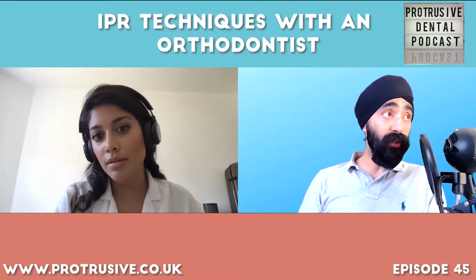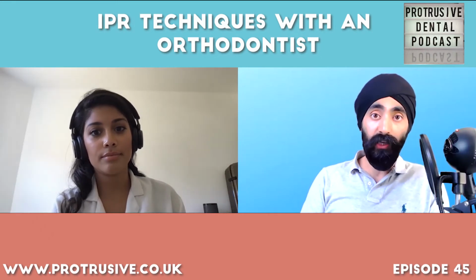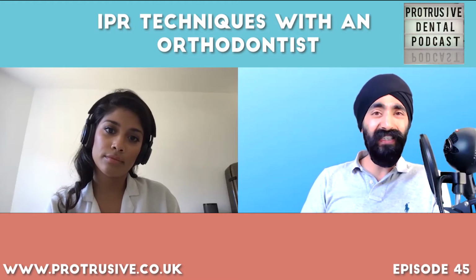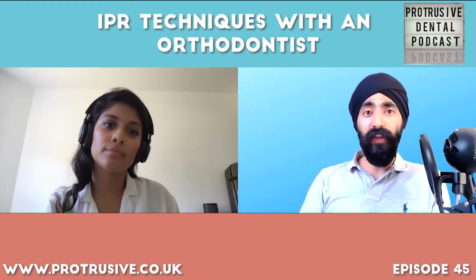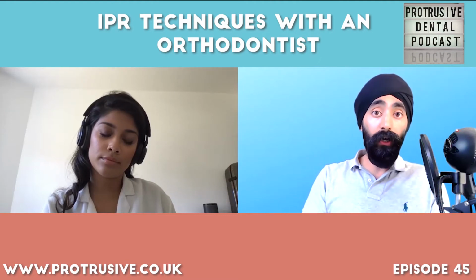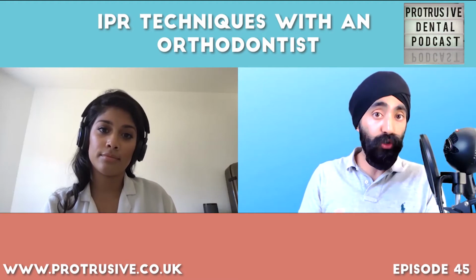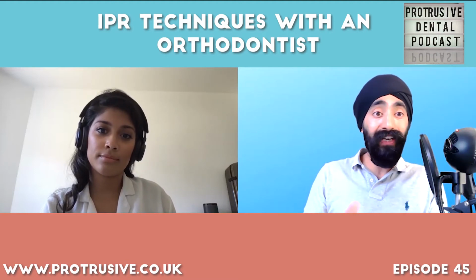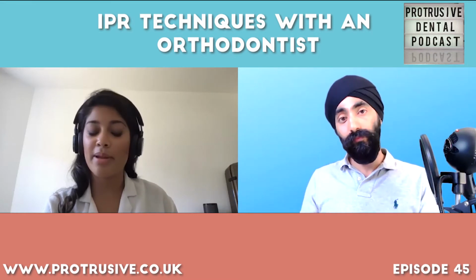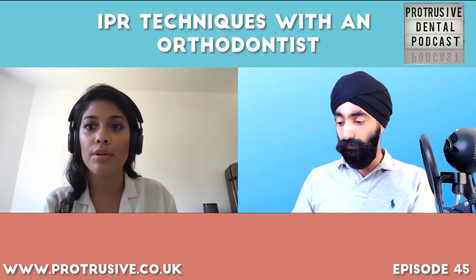And as a restorative dentist, I like using the BioClear matrices to close these black triangles. So sometimes where you see that it's going to be difficult to close fully, then you could tell the patient that, look, there may be some additional procedures you may require afterwards with composite or whatever to make sure we can get the full closure that we want. So it's often unrealistic to say that orthodontics alone will sort it, but obviously it's case dependent. Yeah, it's case dependent, but I completely agree. You're right, and it's good to have that alternative option.